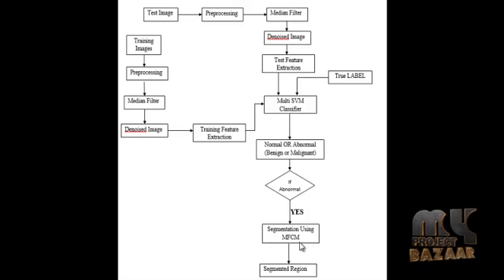The quantization of the feature vector is performed by masking the lower m bits of the feature value. The quantized output will result in common intensity values for more than one feature vector. In the next step, grouping of feature vectors having the same intensity values is done. This process is called aggregation. One representative vector from each group is taken and given as input to the fuzzy C-means algorithm. Since modified FCM uses a reduced dataset, the convergence rate is improved as compared to the normal FCM technique. This technique includes similar steps as FCM except for the variation in the cluster updation and membership value updation criterion.